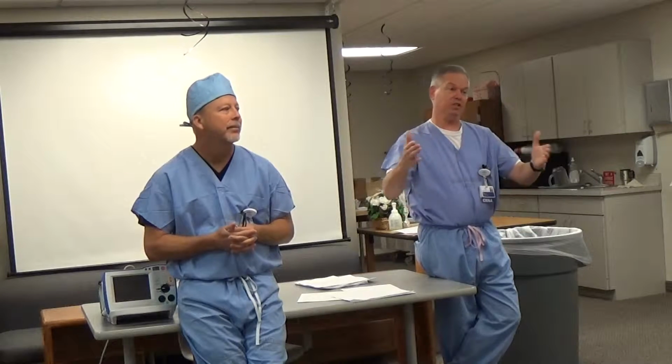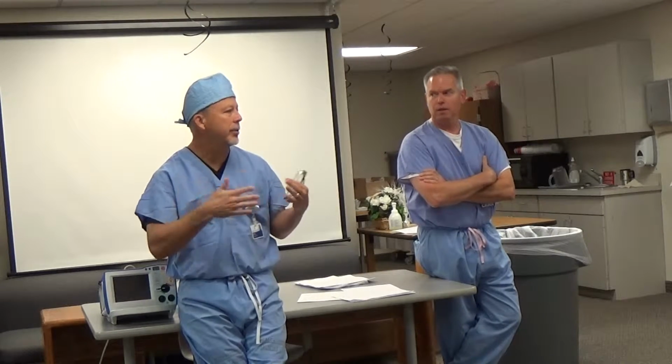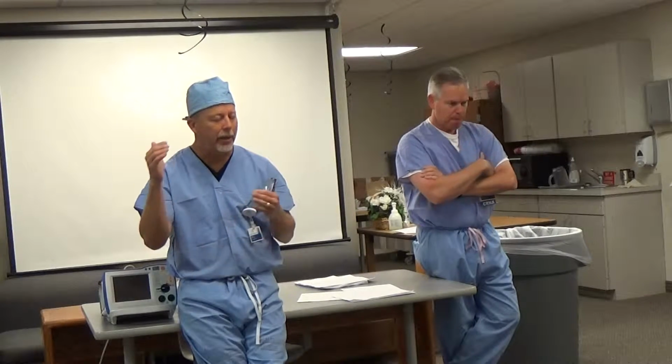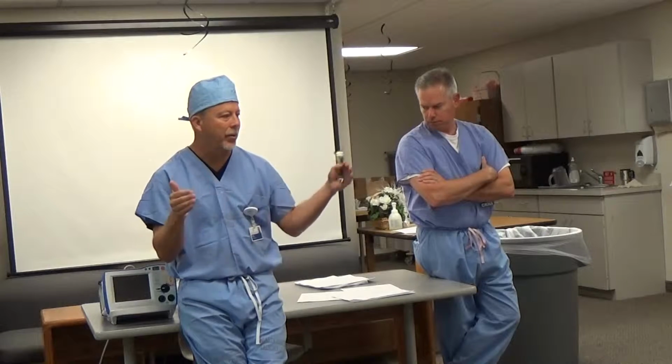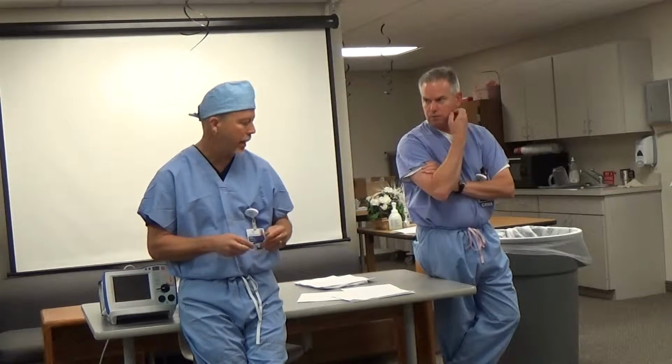Nobody's going to say, oh, this kid weighs about 35 pounds, but most of the time we'll know, because we've already dosed their drugs per their weight. So we should know that, whoever the CRNA is up at the bedside. But once again, it's very important for a pediatric patient in PACU to establish the airway. That is the number one thing the nurse and the CRNA should go for in the beginning, and then call for the cart out of RCC. That was the point of that.